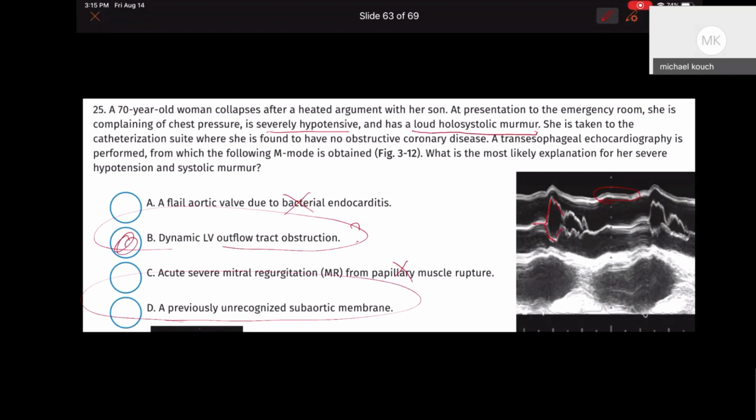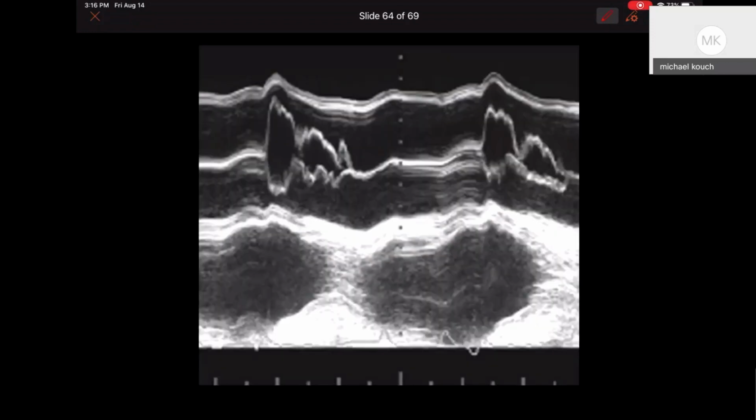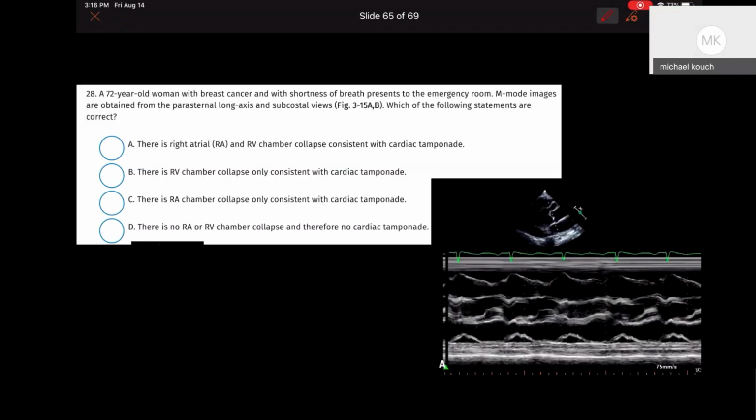All right. Can you get this in a 70-year-old without a subaortic membrane? I would say no most often, but a lot of times if patients are hypotensive, they can have a relative outflow obstruction. So you'll see patients when they're really hypotensive and they come in and you see evidence of this, you give them some fluids and that goes away. So I don't think this is congenital hypertrophic cardiomyopathy, but rather related to something else. Okay. Again, so this is early closure, right? And we see a dynamic process across the aortic valve. All right. We only have, I believe, 2 more questions.